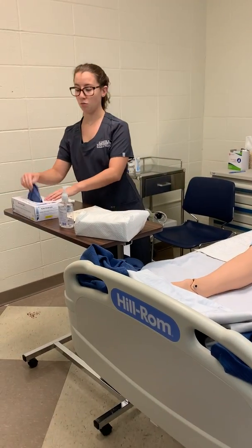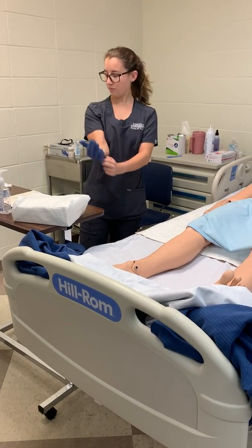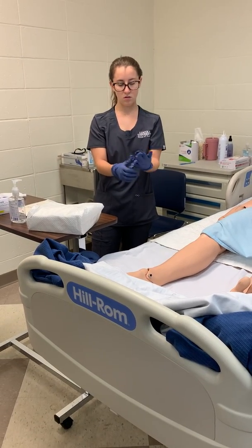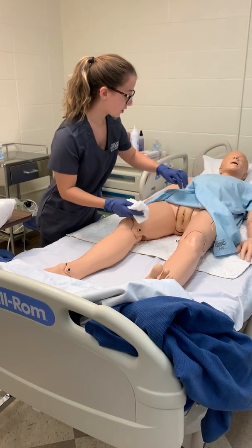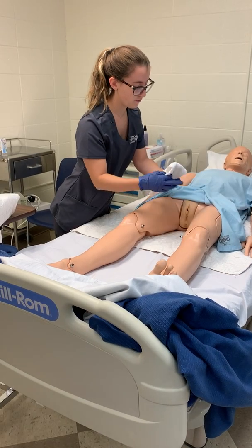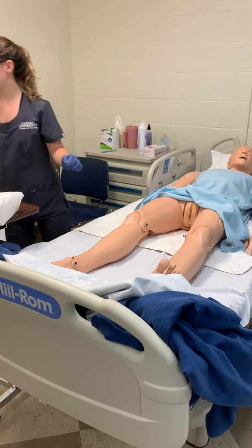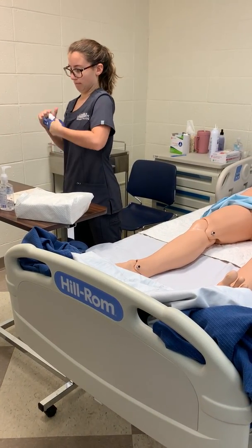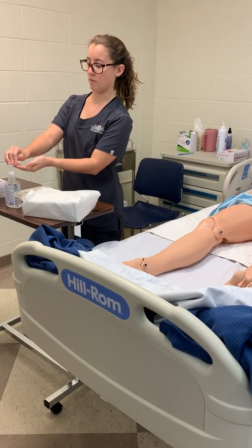And just put on clean gloves while I clean her peri area. And I'm going to use a washcloth to do so. Alright, Miss James, I'm going to go ahead and clean your peri area. Okay, and I'll discard of that in my gloves. There we go. Perform hand hygiene once more.